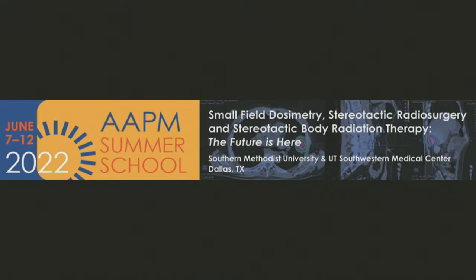And then really visual, if you have landmarks, again, bones should not deform. Anything around the area that you are looking at that can help you visualize that you are really getting a good match. So anything, edges in your images, for example, that can help you. But like I said, it's a tricky one. There's not a ground truth, and there needs to be more work on that.